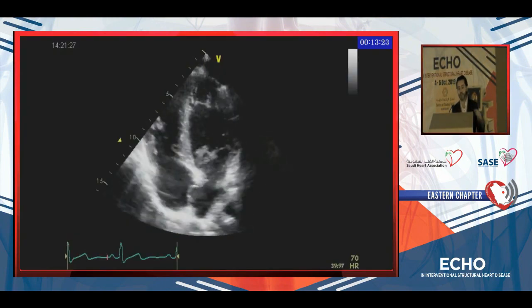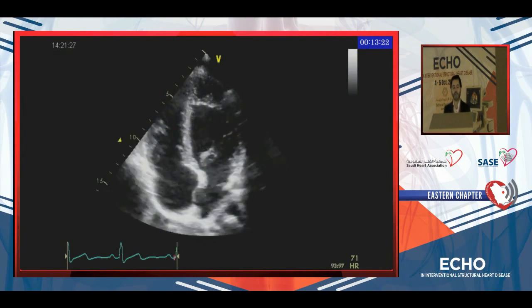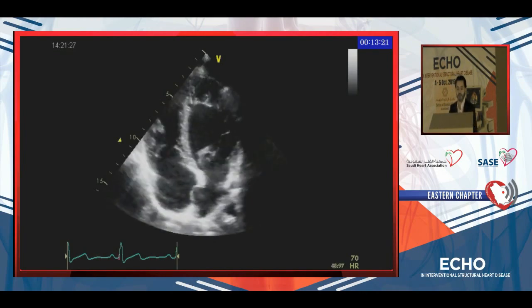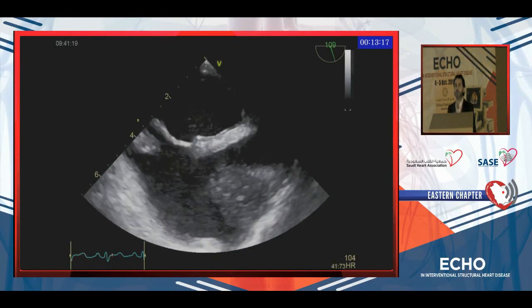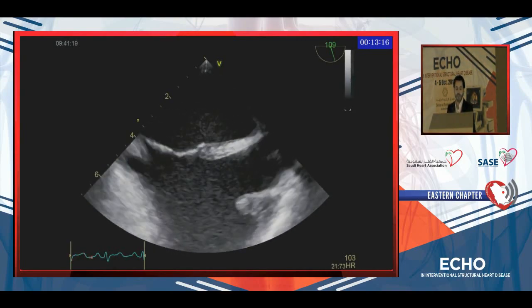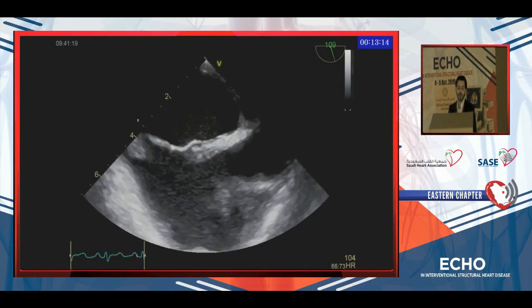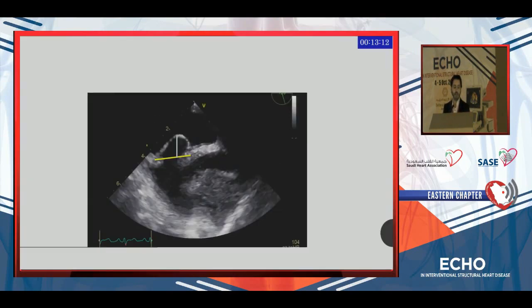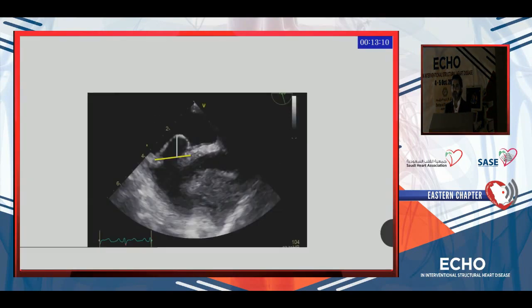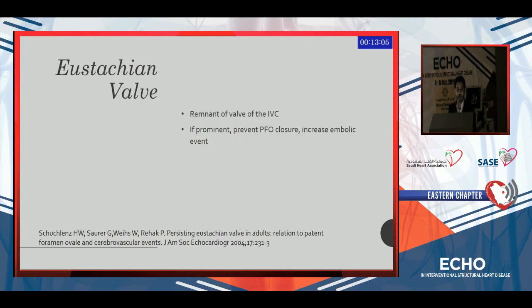This is an example of atrial septal aneurysm on transthoracic echo and this is how it should be measured. This is another example from transesophageal echo. This is almost a bicaval view and this is how it should be measured — you measure it from the septal plane, measuring the excursion. More than 10 millimeters defines an aneurysm.